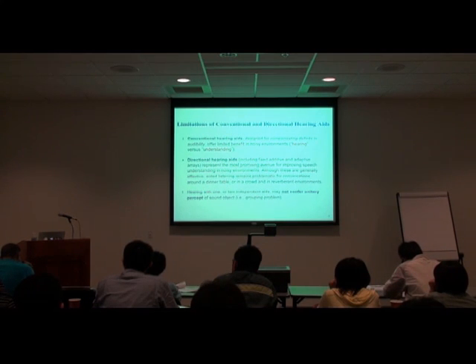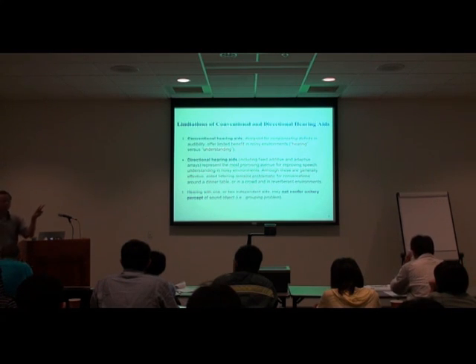When you have a non-linear system, you have a problem, because our ears are used to processing signals that are transformed by our ear canal, and they have certain expectations. As I said, you have to group the information and then segregate information from one stream to the next.